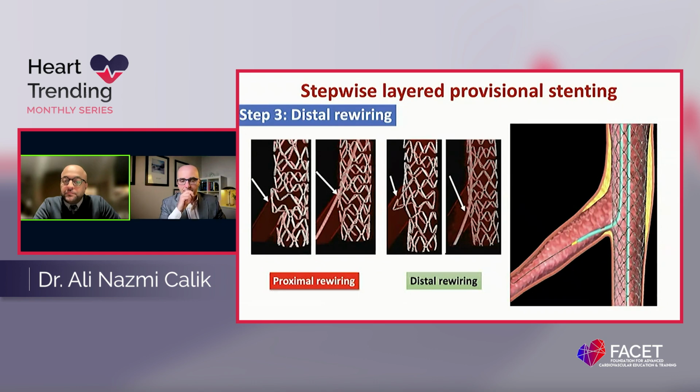The distal part? Yeah, of course, it is important, Chadi. If we have challenges with wire rewiring, of course, we have to give a second angle to the tip of the guide wire. So it will allow us to easily go through the distal struts. It will direct us to the side branch through the distal struts.